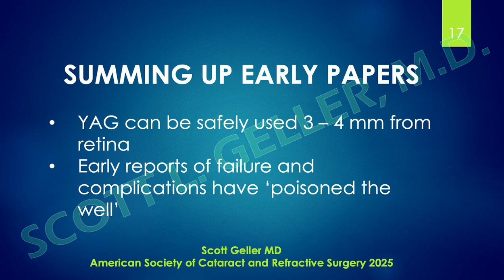So who is this Dr. Scott Geller saying that he can work 3 millimeters from the retina safely when there's actually stuff in peer-reviewed journals that says that is dangerous? Well, of course it's dangerous if you don't know what you're doing, but if you are skilled at it, you certainly can come to the same level as me. You do have to have the right equipment.